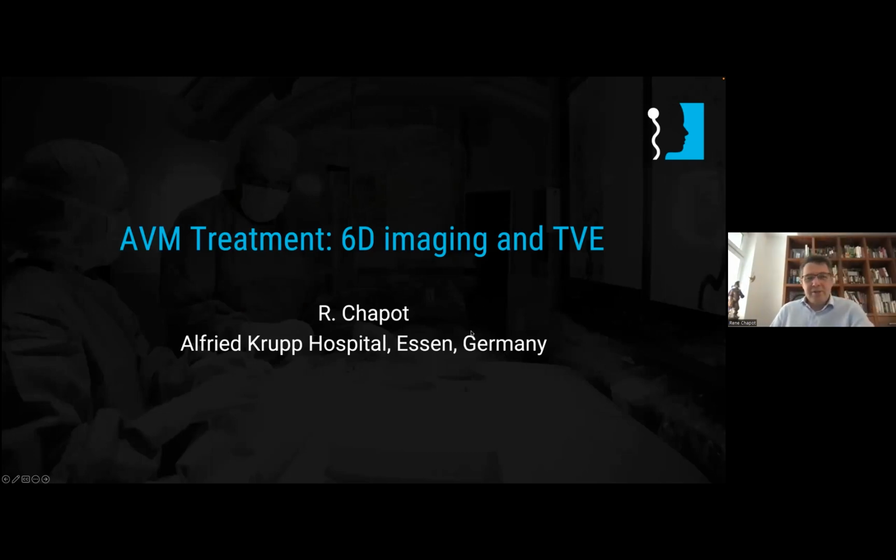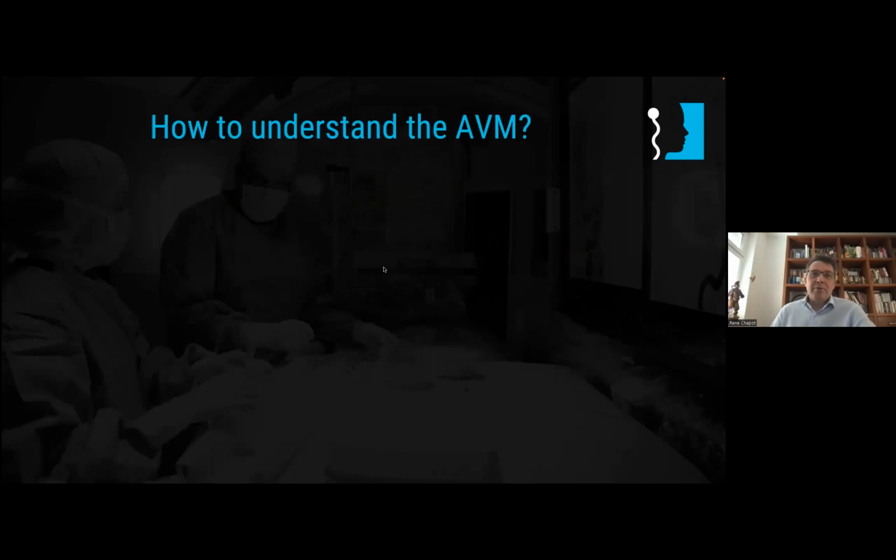I'm going to show you other ones, but all this has the same goal, to understand what we do and how to understand. That's the difficulty of AVM, because usually most of the understanding is obtained during injection. You inject from the artery, you arrive in something, you don't know what it is, and when something becomes very large, you say, oh, it's a good thing.